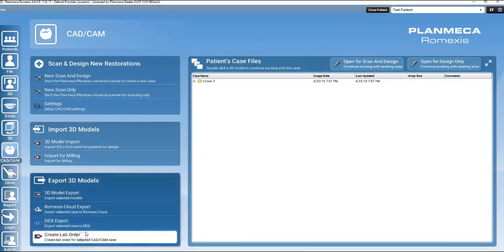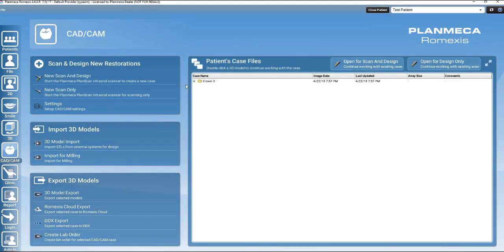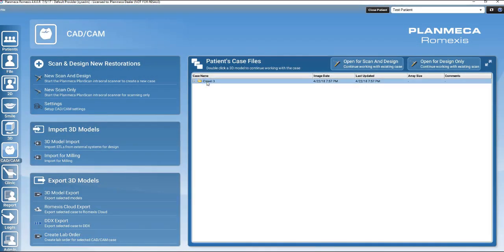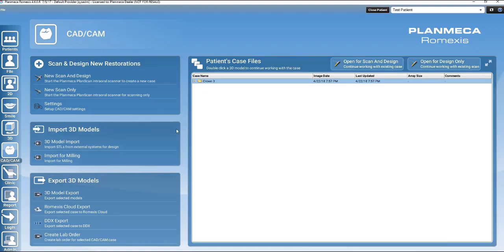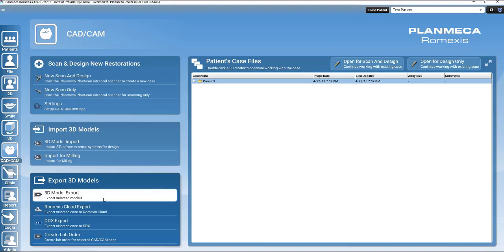and highlight the yellow folder of the desired case to send with a single left click. There is a box on the lower left-hand side called Export 3D Models. Click on the first option, 3D Model Export. A dialog box will open.